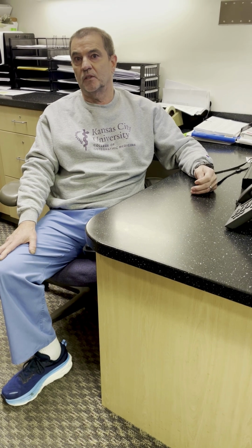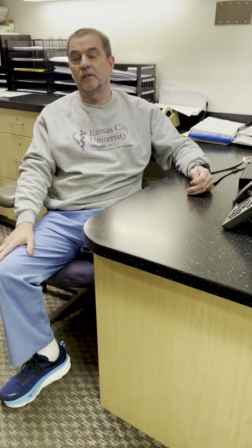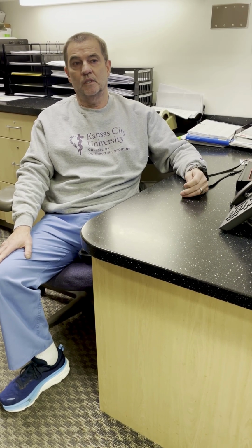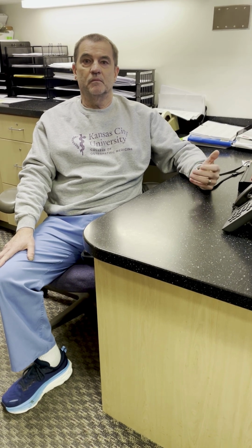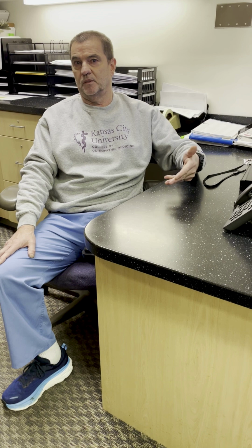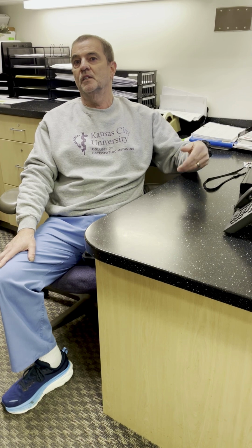Now, what's happened more recently, particularly with the availability of and experience with laparoscopic surgeons that are adept at and willing to do intraoperative cholangioscopy through the cystic duct, and even do interventions such as stone lithotripsy, or stone extraction, or even flushing stones through the papilla, surgeons can do laparoscopic bile duct exploration. And what many people don't understand, even some gastroenterologists, is that it doesn't involve incising the common bile duct, which is deep, sort of going retroperitoneally and difficult to access laparoscopically, but it involves a transcystic approach.